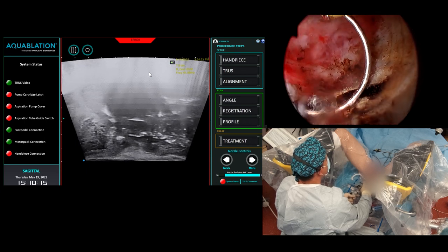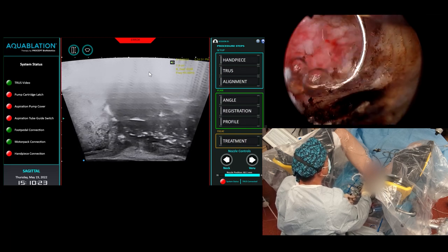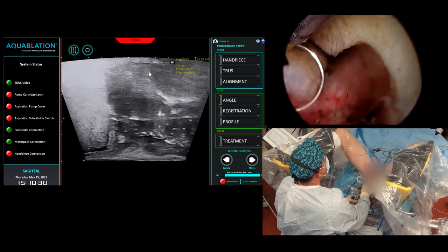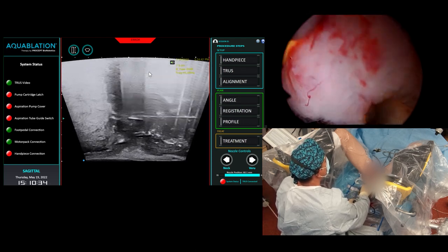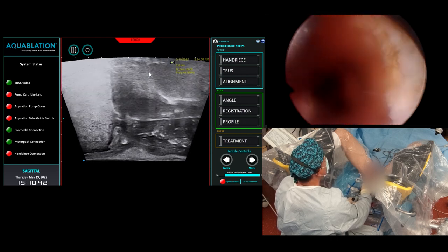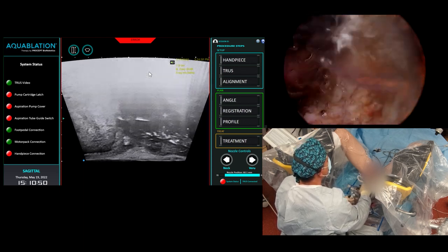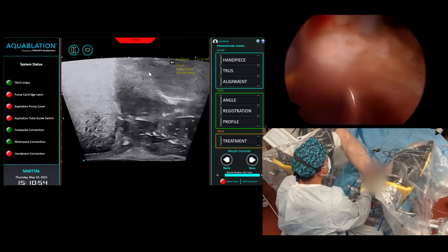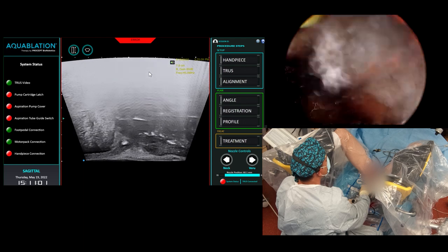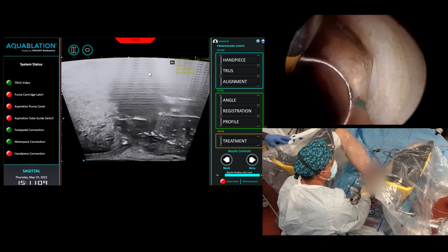Bladder looks good. This is all fluffy tissue — let's take some of this fluffy tissue down. We'll open this up a little bit more so we can see everything. I have a bipolar instrument here. A lot of the older guys I work with use monopolar — probably a little more hemostatic — I just never did in practice. There's a lot of tissue still left here. This is a humongous prostate. I think it's a nice channel, but you can see on the ultrasound there's anterior tissue. I'm going to open this up just a little bit more so I can see if there's any bleeders.